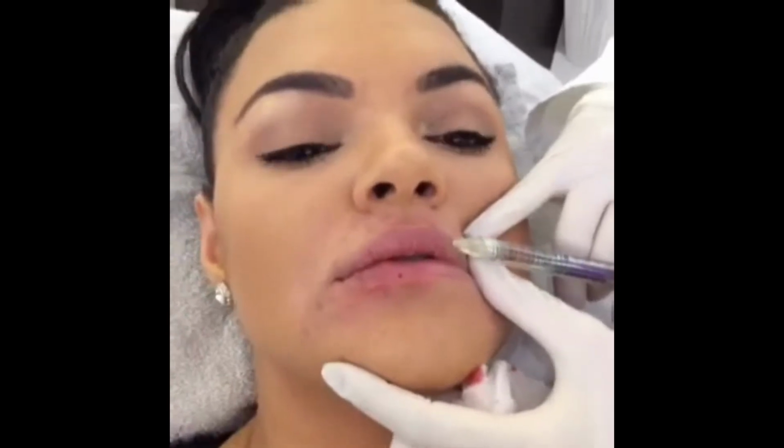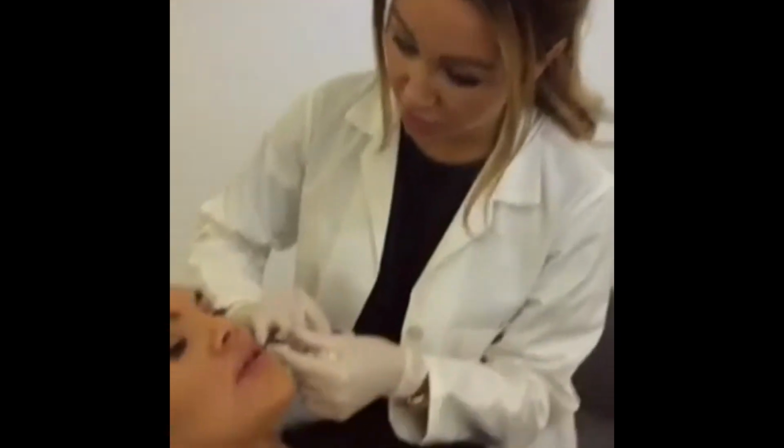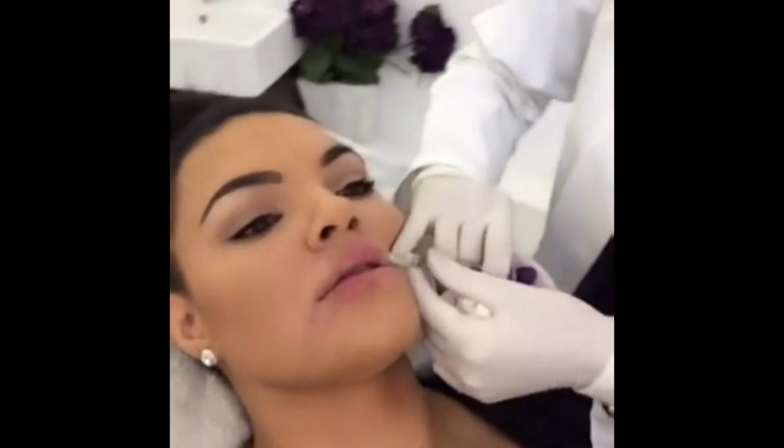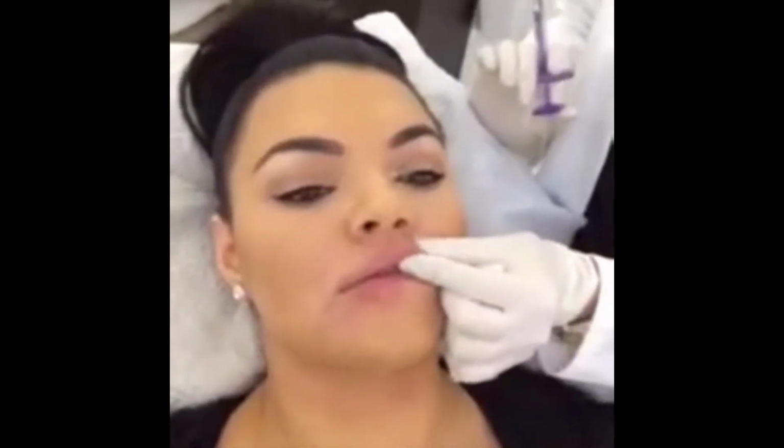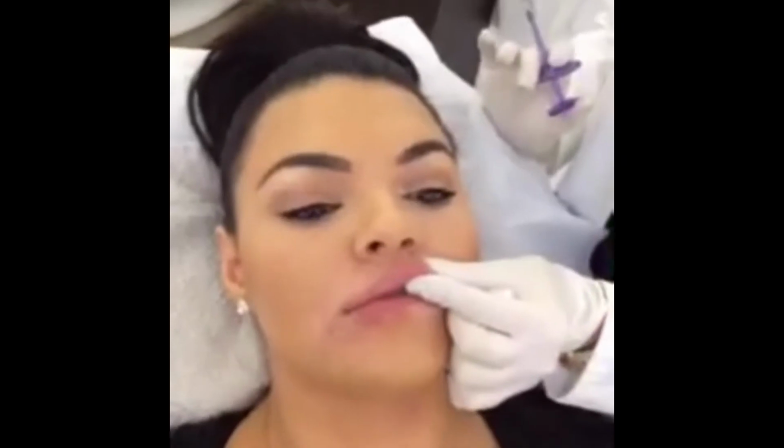How much filler do you know how to ask for, or do you decide that? I think you should decide this with your practitioner, depending on the look that you want to achieve. Here, because Natasha's got quite a big lip pocket, she has had the treatments in the past before, about 9 months ago, and she commented that she had about half a syringe. She didn't really see much difference. So definitely for her lips, 1 mil, 100%.